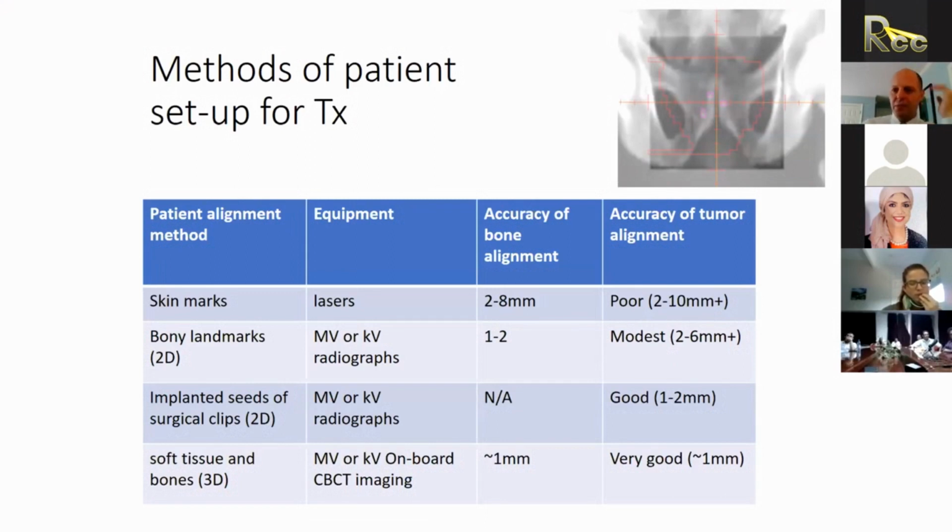If it's a smaller field, like a head, in those cases you don't need to offset your detector, and so you get a full projection of data for each angle. Often you can get away with just a little over 180 degrees, usually around 200 degrees for the scan. So you can do it either way, and it depends on how big the anatomy is.